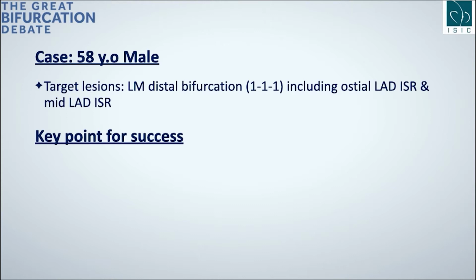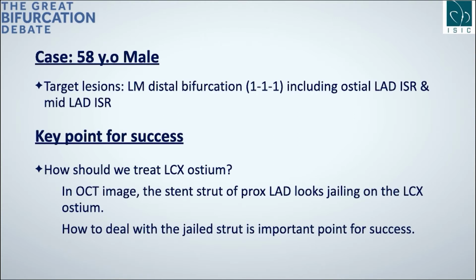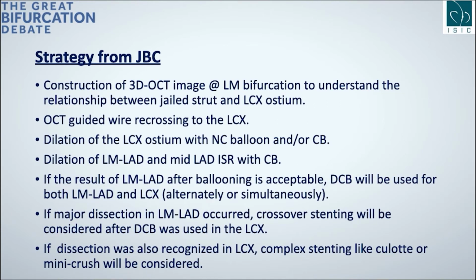We think that the key point in this case is how we should treat the circumflex ostium. The OCT image from distal LAD showed the circumflex ostium was jailed partially by the stent strut of the proximal LAD. How to deal with this situation is very important to get an optimal result in this case. We showed the strategy from JBC here.